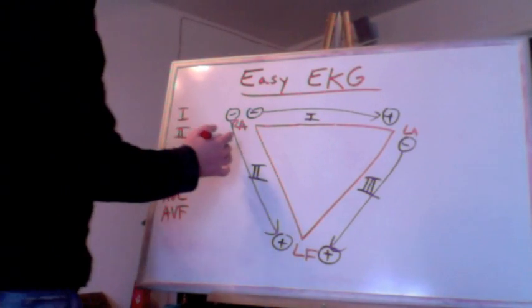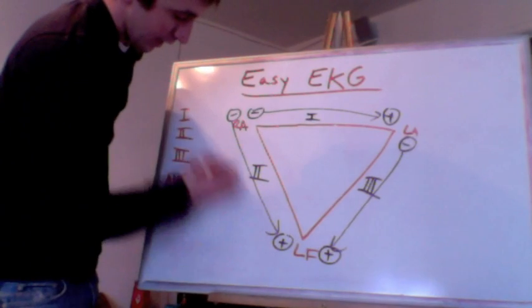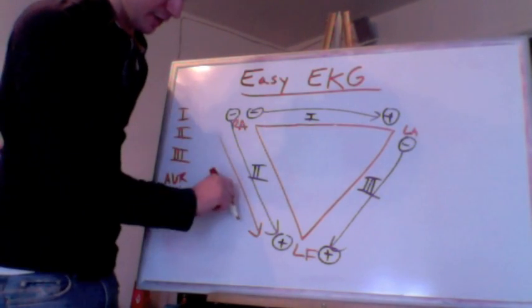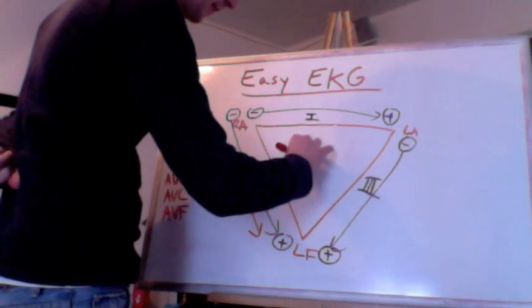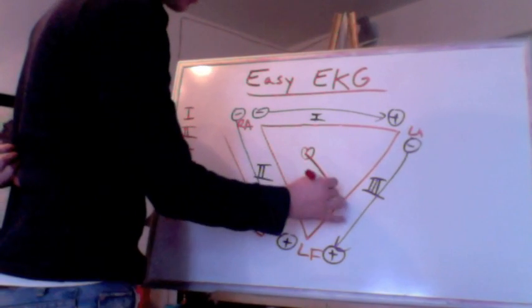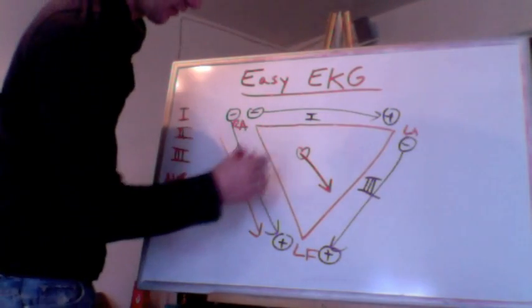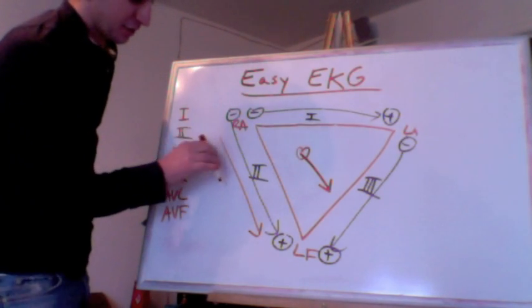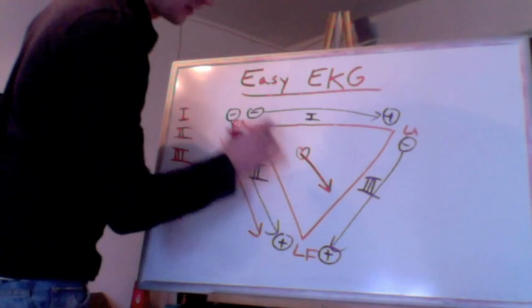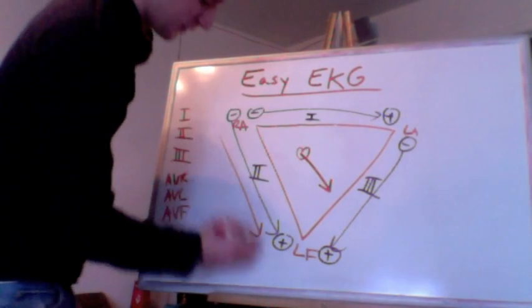So let's see if we measure from lead 2, all right? So the direction for lead 2 is this way, right? So we're measuring the depolarizing direction, this direction. The heart is here. Remember what the net depolarization direction for the heart was? Yeah, it was down, this direction. That's why lead 2 is the most commonly used lead, because it's the most positive, because it's the closest measurement axis of the depolarization of the heart that you can get. It's just this direction, all right?